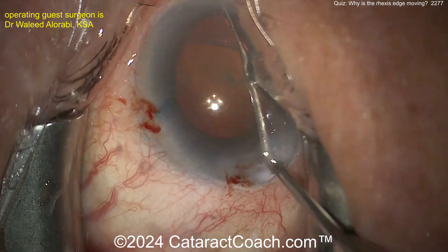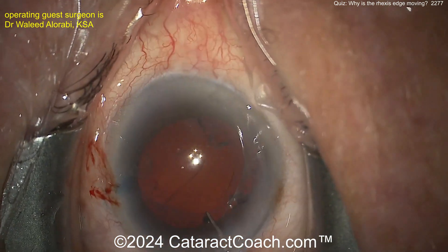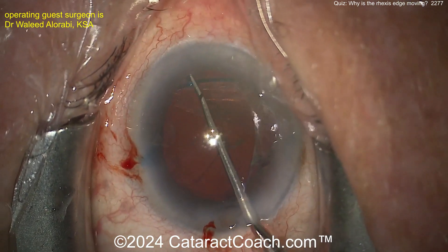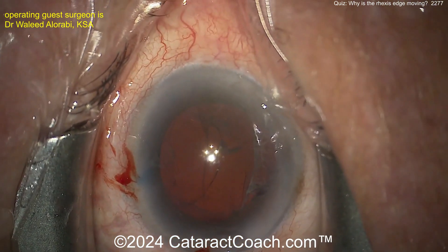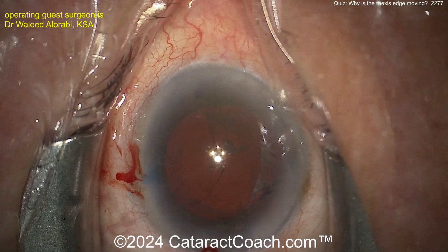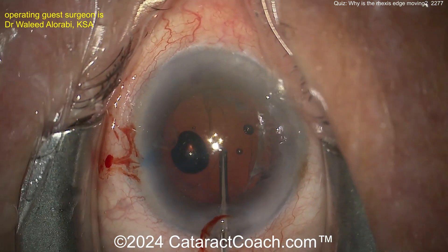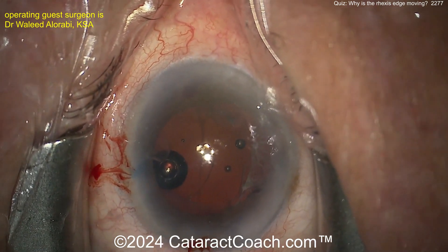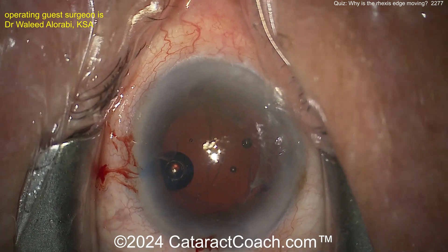Now probably a CTR. Looking around, maybe just lifting up the iris — okay, there you can see: wow, it's an extensive area, at least three clock hours of zonular loss.